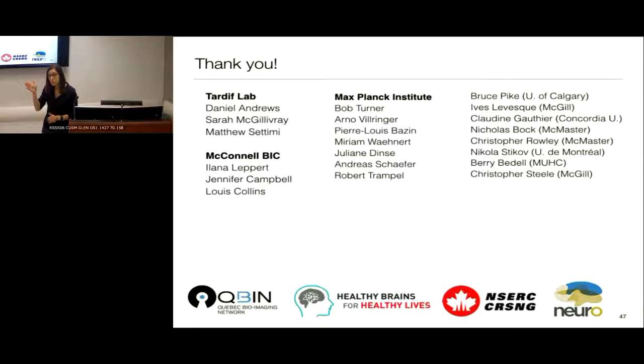And even in images where we look at them afterwards and say, yeah, that's great, it passes my QA, there are subtle effects, because it can just be a little blurring and that will affect your morphometry down the line. So in cases like depression, schizophrenia, honestly so many diseases, where the motion matters, like ASD, autism, some kids may be more agitated, ADHD, the kids may be more agitated.